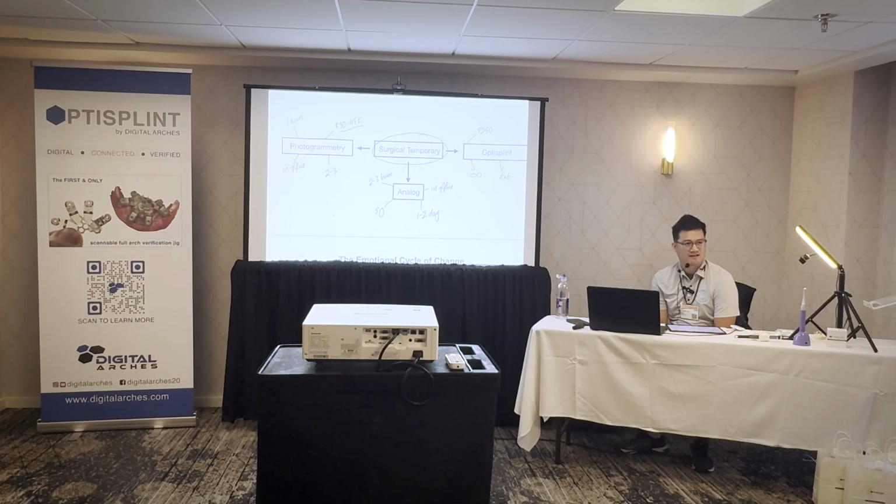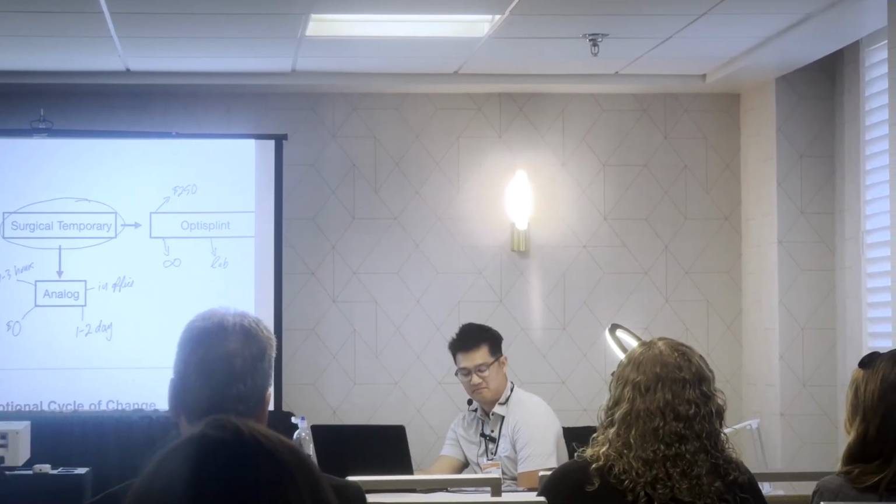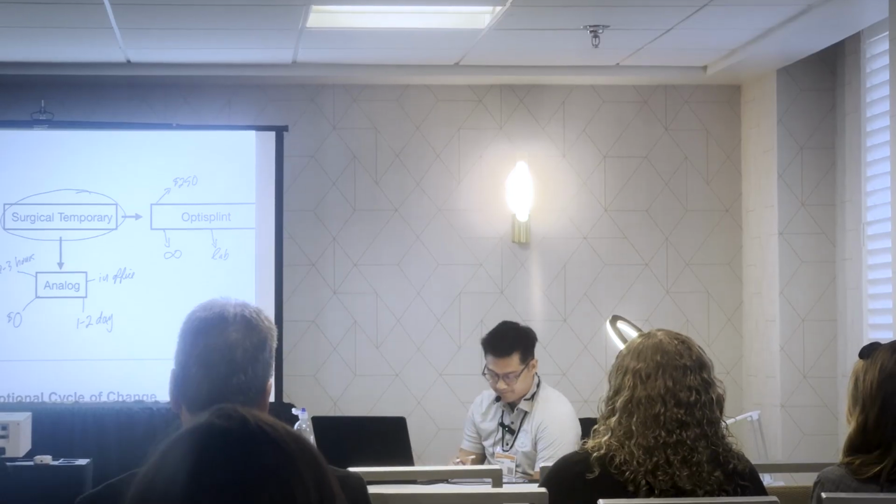Putting on 4 scan bodies and then doing the scan, usually 10 minutes, 15 minutes max. A little high. So let's call it 10 minutes, that's safe. For iCam, for 4 implants, you get the scan bodies on, and it's a simple case, 6 to 10 minutes.